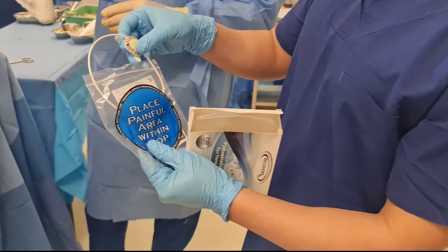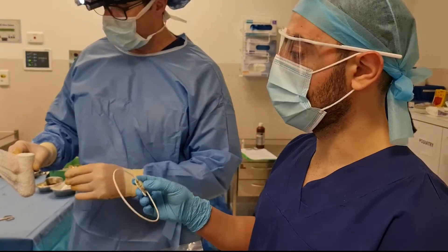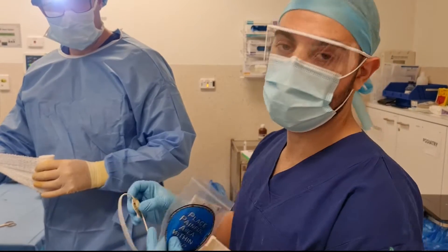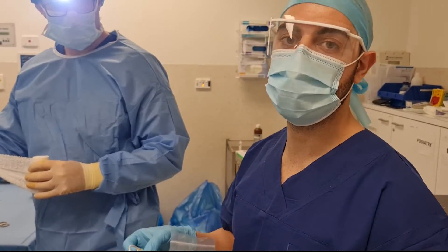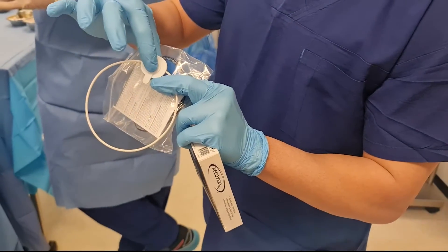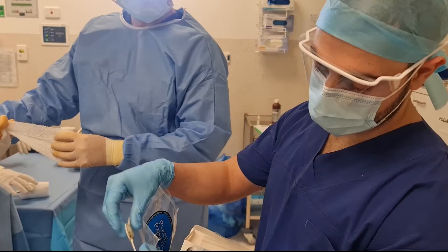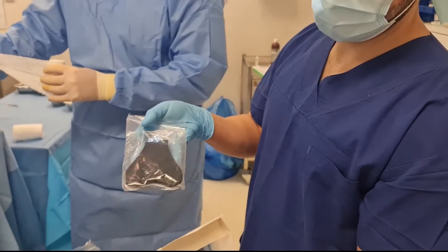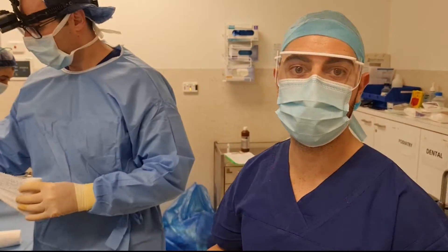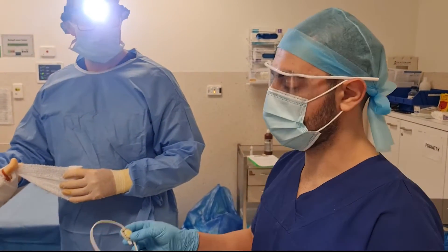This can be worn 24/7 by the patient. It lasts about 720 hours and once it's applied it starts to work, increasing in effectiveness over time. It's simply operated by pulling off this tab and pushing a button for two to three seconds — a short light will come on. Once placed, it's secured by a kinesiology tape that comes in the pack. It helps reduce the need for opioids after surgery and the reliance on any pharmacological products.